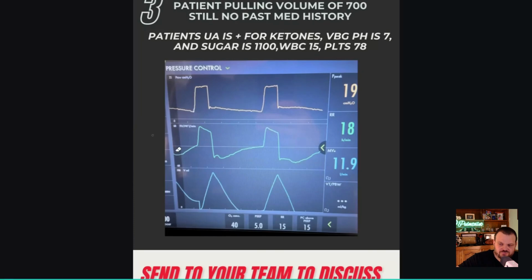Maybe there's some early cycling here, so the patient wants a longer breath, at least in the second breath, which we could definitely play with the I time and make the vent fit the patient a little bit better. The last thing that I wanted to point out is, the patient in these situations, if they're breathing spontaneously, is going to drive their minute ventilation for whatever it's going to be. So whatever the patient in their brain needs, they're going to do with the ventilator. It's just how much support you're going to give them, or how little support, or how much are you going to put them in harm's way with the vent.